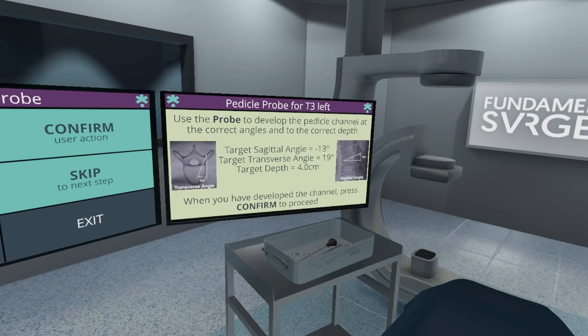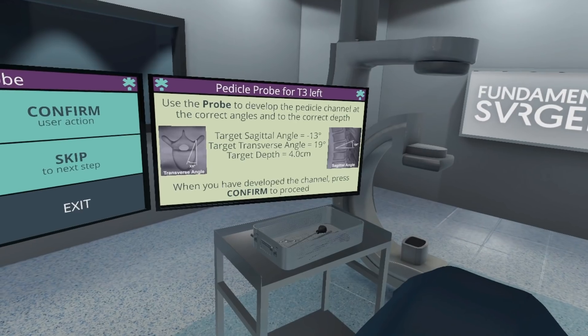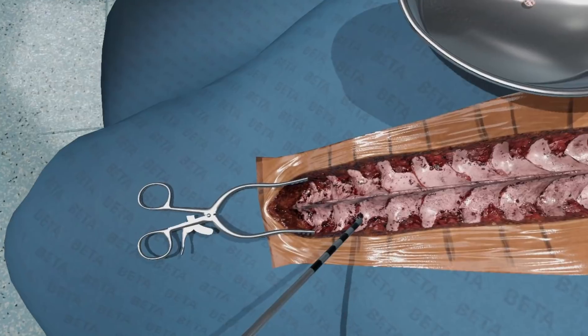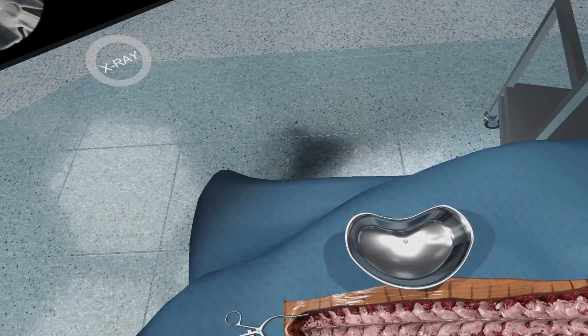The key part of the instructions is to teach people how to make the actual probe into the channel work — to give them the correct angle and then to measure it. Using the calibration on the probe, I'm able to go into the correct depth and at the required angle.